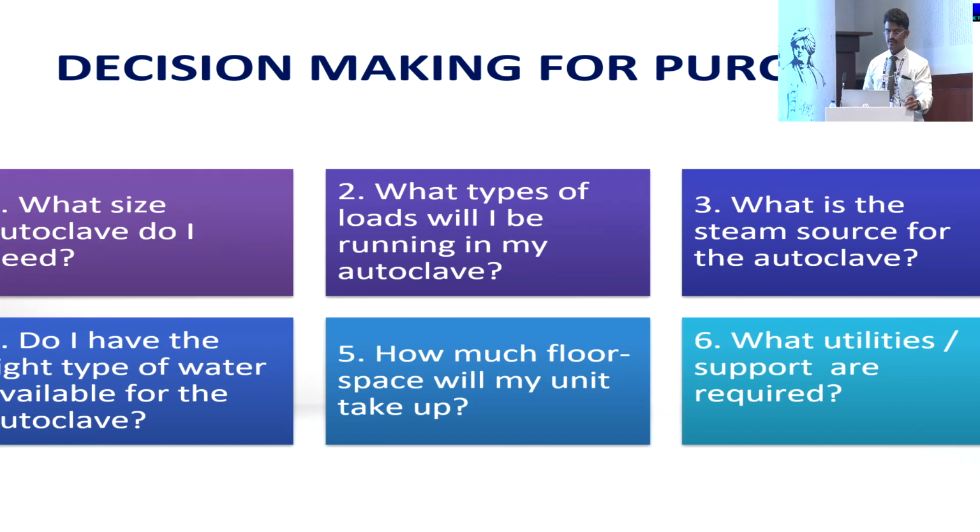So what are the questions or the checklist that you need to check before you buy an autoclave? First and foremost, what is the size of autoclave I need? Secondly, what types of loads will I be running in my autoclave? These are questions that are personalized to each one's practice, so accordingly have to be answered. What is the steam source available for the autoclave?